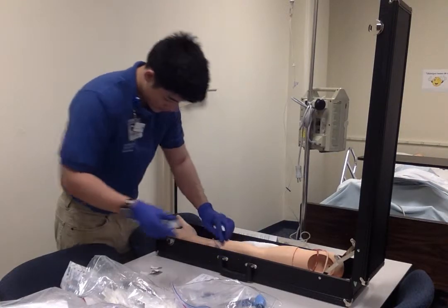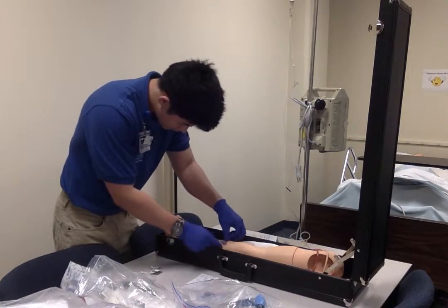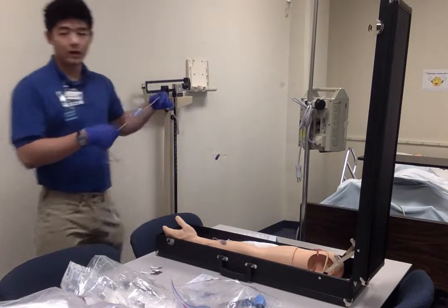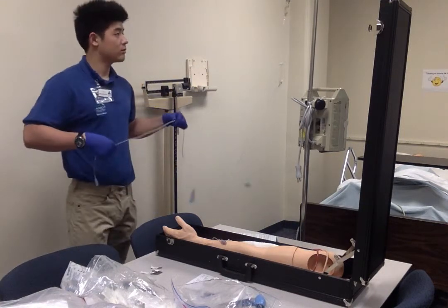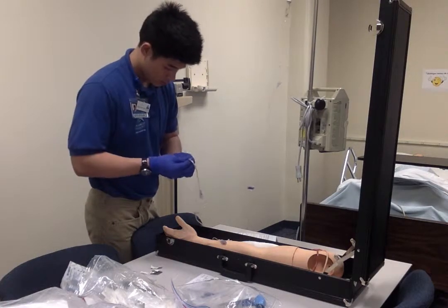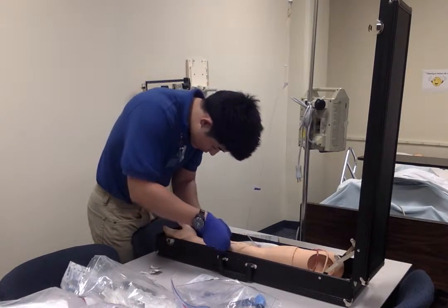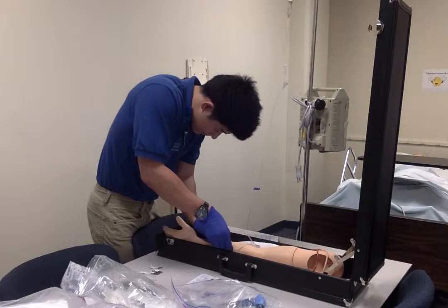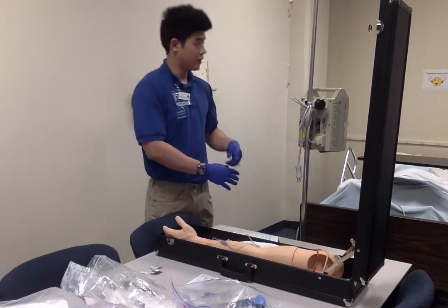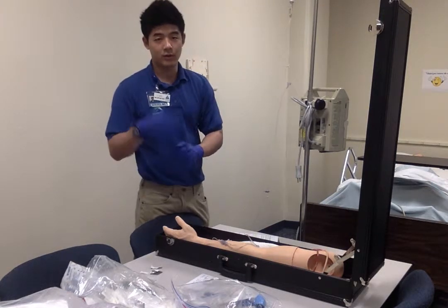Take this off. Now, medication. I'm going to go ahead and set my drops per minute, which is 1 drop, and it's going to take me forever to actually calibrate.